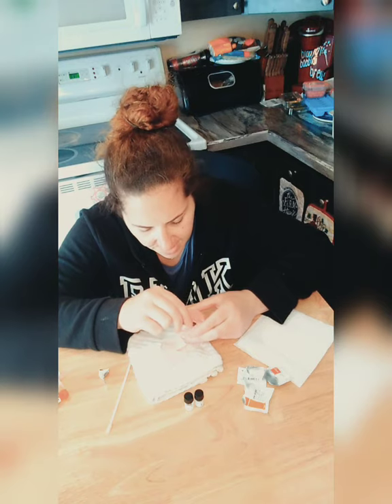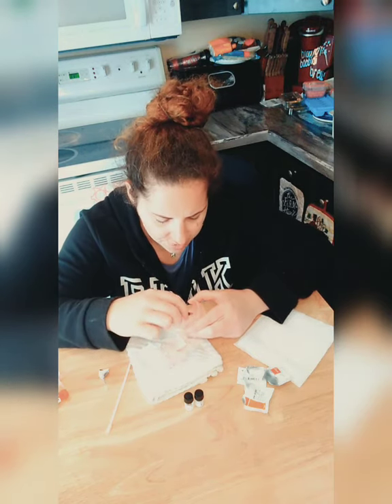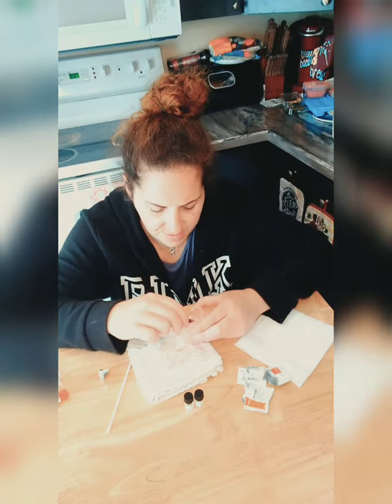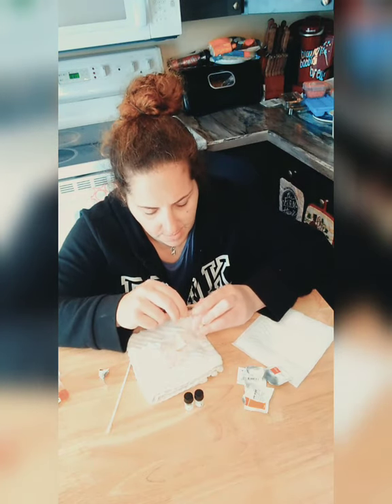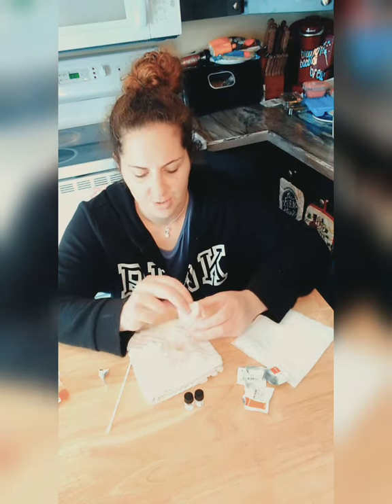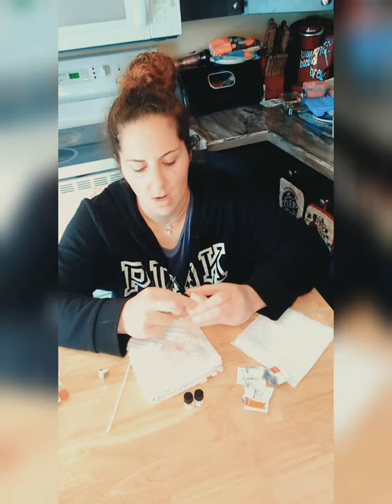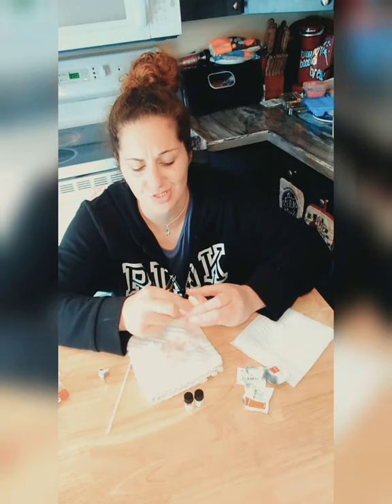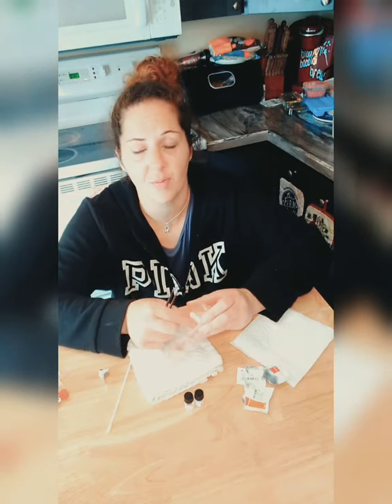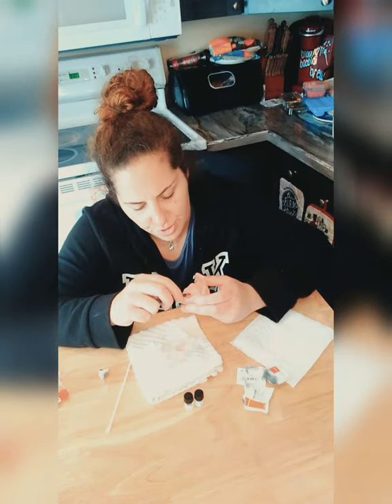I'm basically done. I have that one spot that's already loose — it comes up easy. That Unisolve stuff works great, it really does. I know it only comes with two packets, so for all of you who have a problem, order more on Amazon. Some people have more of a problem — we're all different in how we take this stuff off, which is why I do these videos.